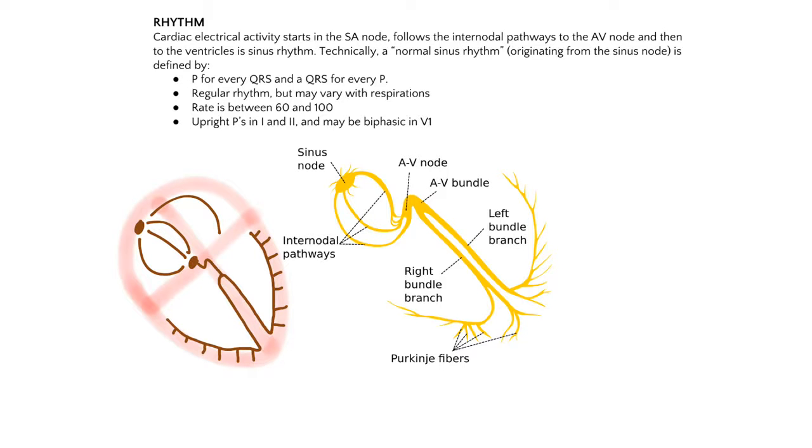Welcome to the second video, and here we're going to talk about rhythm. And what we mean by rhythm is, where does the conduction start? What is generating the rhythm here? And so you remember, you were taught this conduction fiber system.